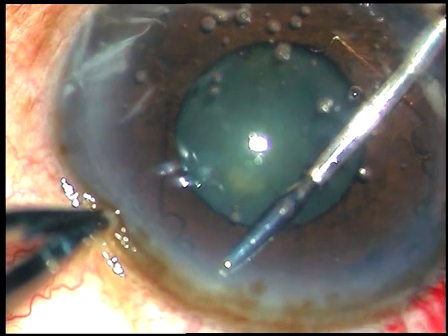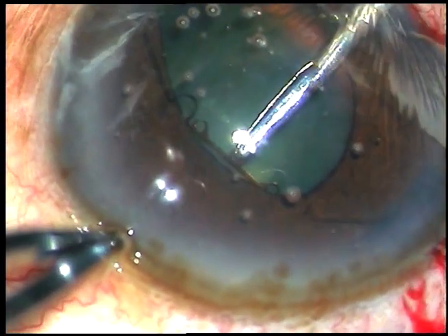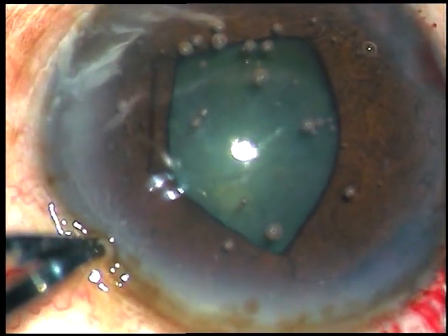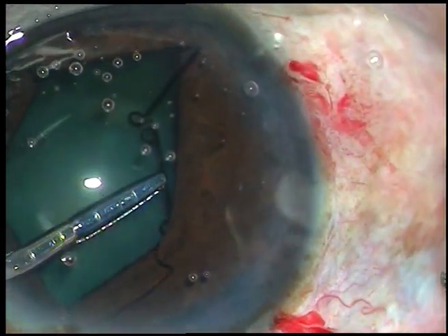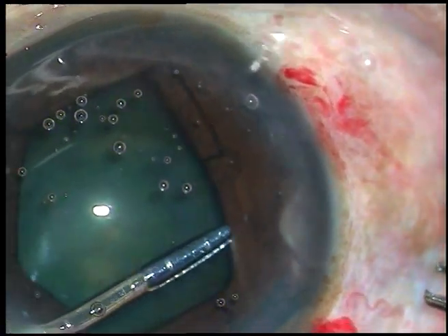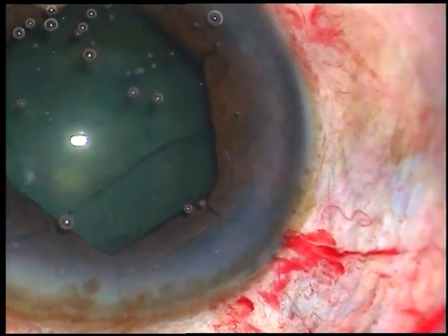It is very simple. Now you fold the other flange — the flange which is at 1 o'clock — and tuck it like this. Be very gentle, otherwise you can injure the anterior capsule, which you are going to see in the next case. Once you have tucked all the flanges, just do capsulorhexis and then phacoemulsification.